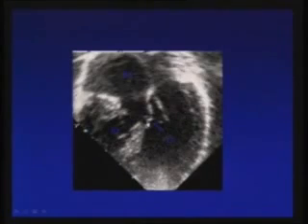Single ventricle physiology with restrictive interatrial communication, LA is dilated, pulmonary veins are too prominent because of the pulmonary venous hypertension.